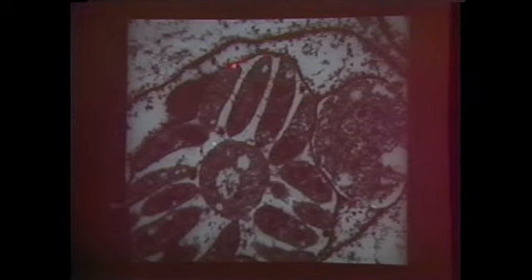And they have all the structures, of course, of apicomplexa, right there. And this is the host cell nucleus. I had never seen a coccidian in the nucleus. I mean, usually they're in the cytoplasm of the epithelial cell. Look at this. What do you think this is? Well, this turns out to be a macrogametocyte. These areas are those eosinophilic globules which will form the oocyst.